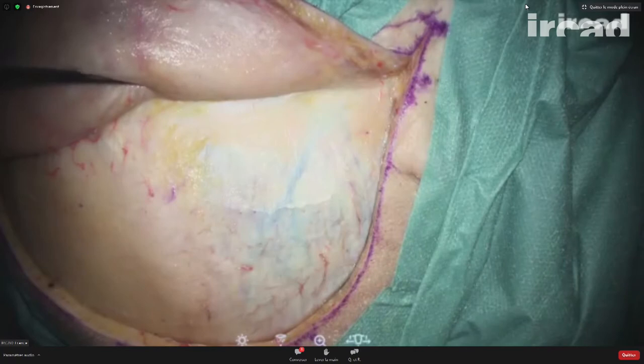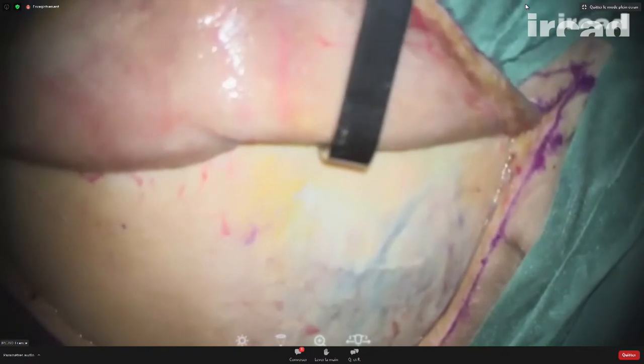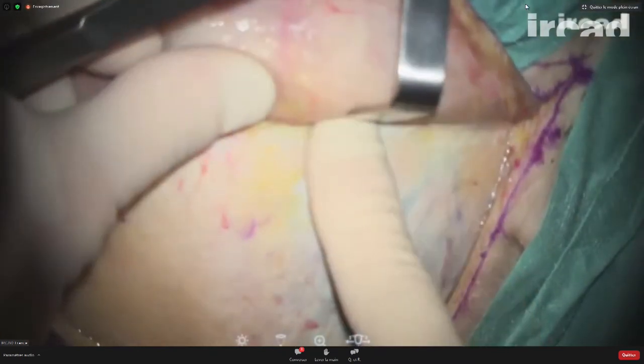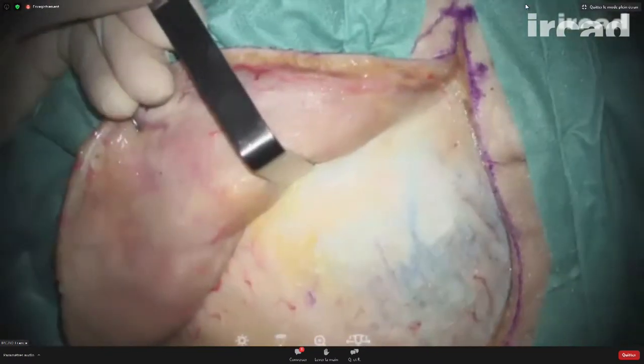Okay, here at some point, when I push the skin flap, I start to feel that I cannot push the skin anymore. I just need to adjust the microscope here.